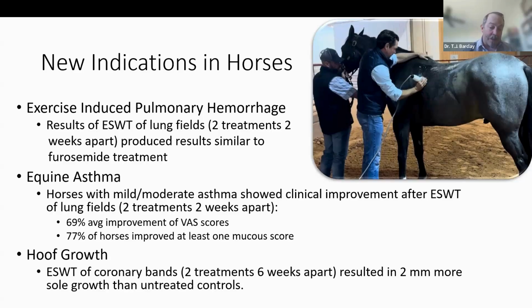There was a safety study done on some horses, treating their lungs, and that work showed that there was no significant damage to the lung surface or the lung parenchyma from a very large dose of shock waves delivered to a pretty focal area.